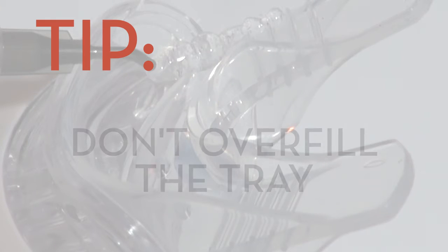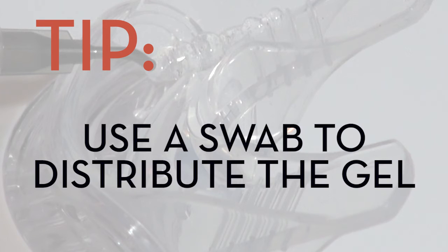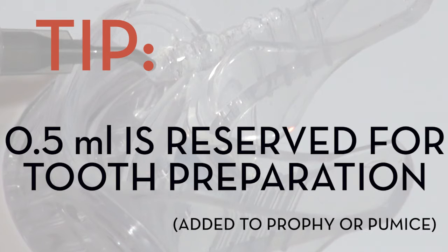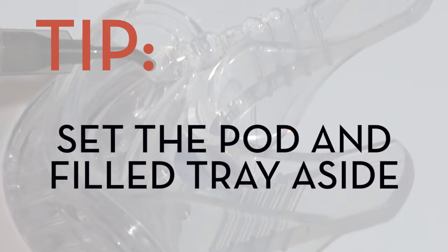Don't overfill the tray — that could lead to some discomfort. If necessary, use a dampened cotton swab to distribute the gel evenly. Half a milliliter of gel is reserved in the syringe for tooth preparation. Set the pod and tray to the side until you're ready to start brightening.